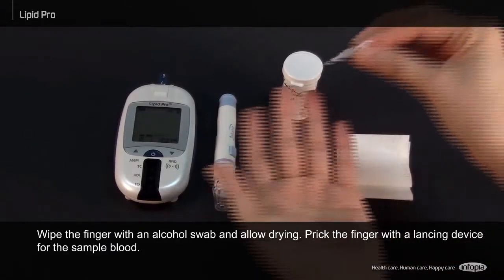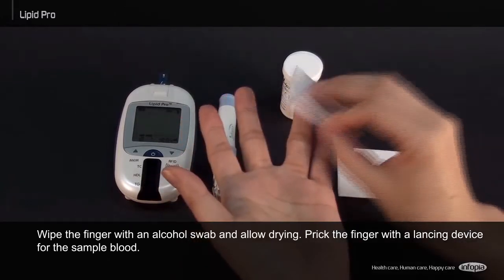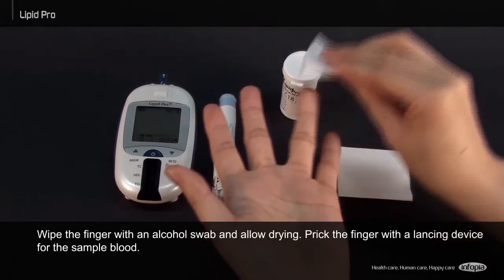Wipe the finger with an alcohol swab and allow drying. Prick the finger with a lancing device for the sample blood.